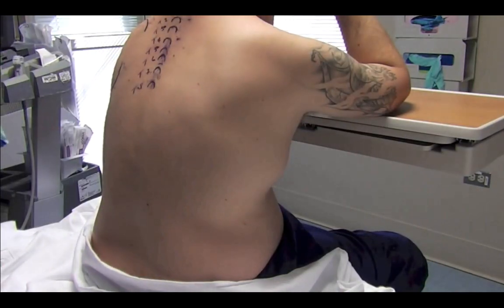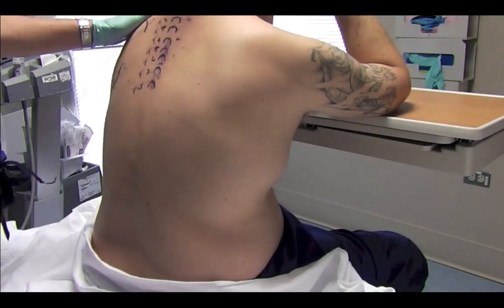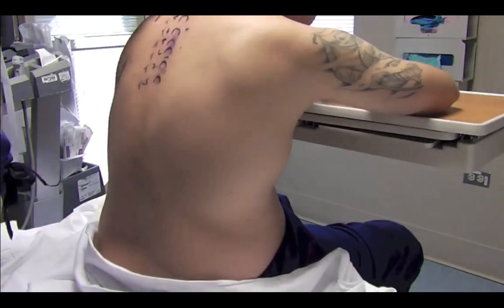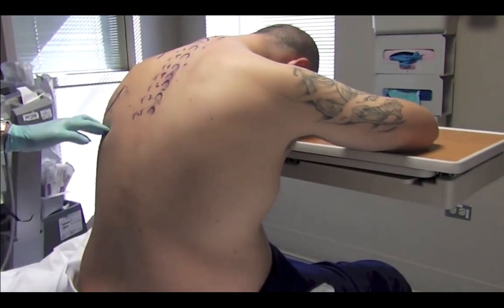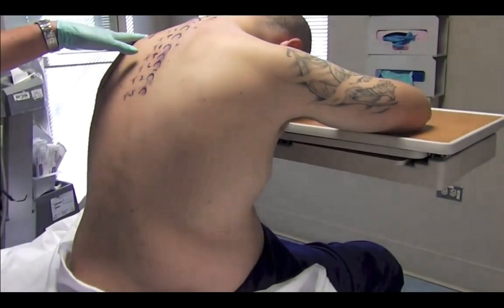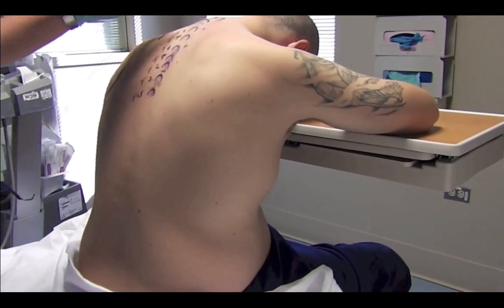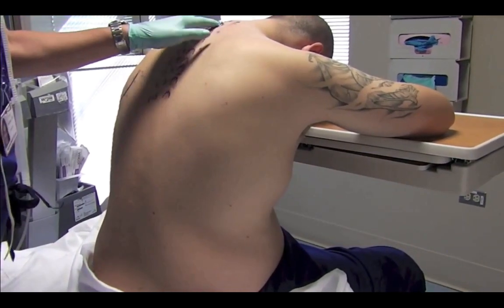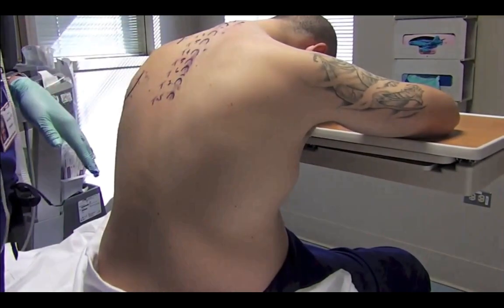At Stanford Hospital, we typically position our patients in the sitting position when we place a thoracic paravertebral block or catheter. On this model, we have marked out the pertinent landmarks. We have the patient lean over a table, just as if we were doing an epidural, and we palpate the top of the scapula and the bottom of the scapula. These typically correspond with the T3 level at the top of the scapula and the T7 level at the bottom. The most prominent spinous process is by far C7, so I usually start there and then palpate my way down, marking out each spinous process and the corresponding level.